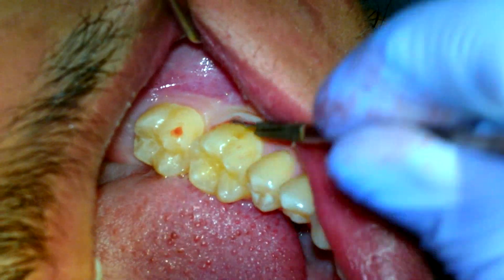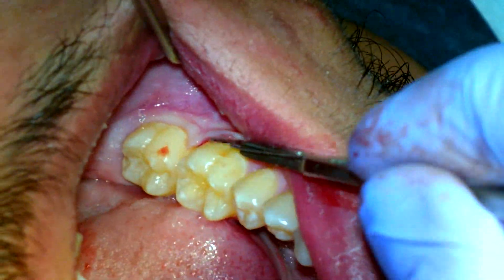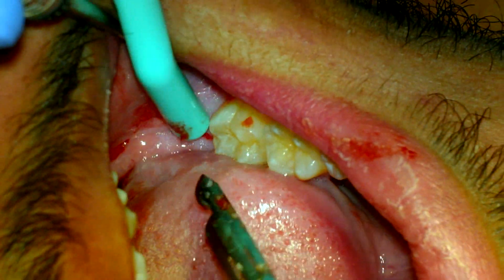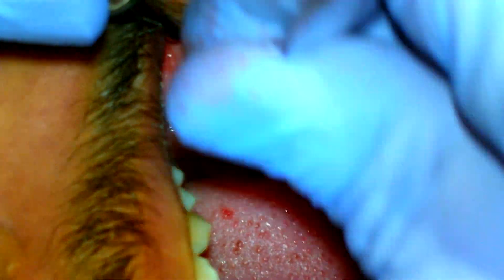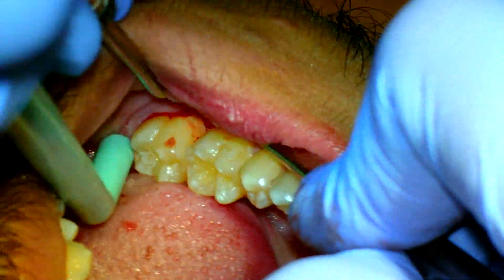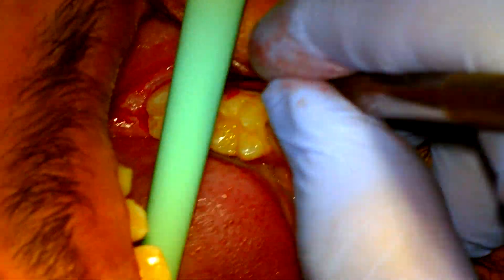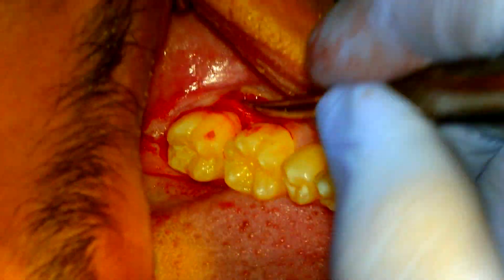I always skip 18 to 19 at the line angle and I flap. When I get to the actual retromolar pad, I make a hockey stick incision. If you have seen the previous videos, this is my favorite — an envelope flap, just like an envelope. Open really big for me, tilt your chin down a little bit. Make sure it's a clean flap because then he will heal much better. Keep suctioning.